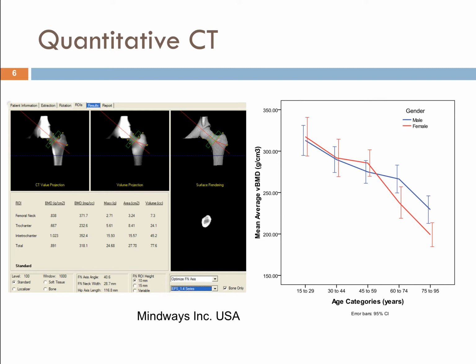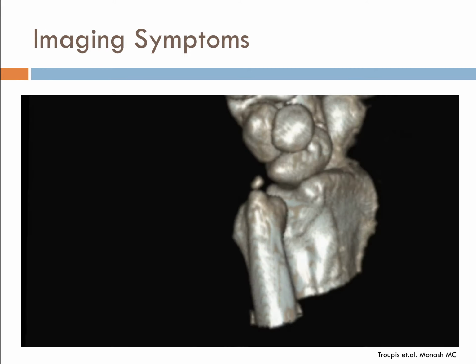And the ability to be able to do this with CT has been quite powerful, and there are a lot of research interests and a lot of companies presently working on ways to utilise quantitative data from CT, MR, ultrasound in various ways to both monitor disease progression and to also look at treatment efficacy as well. It's a very, very powerful way of measuring these sorts of changes within a single patient and within populations as well. And I just wanted to show you this one.